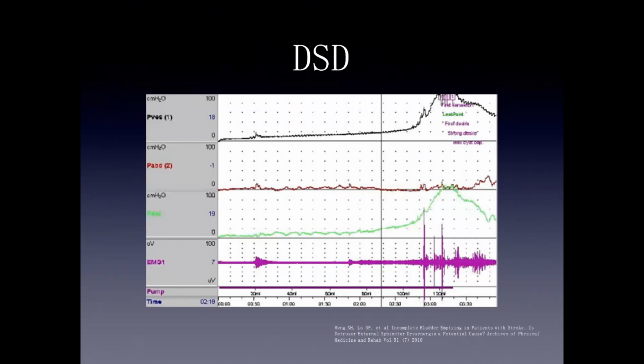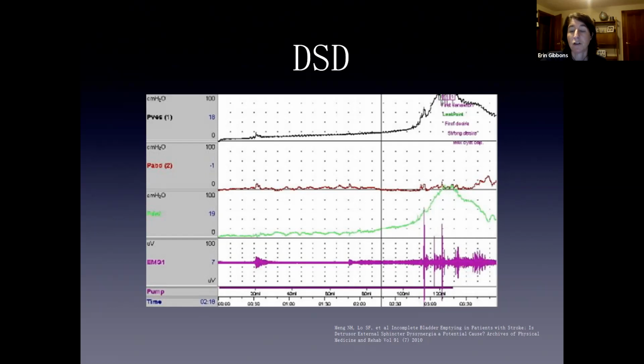You mentioned that it could be DSD or a pelvic floor, like the person is not relaxing his pelvic floor, but how do you make the difference? So yeah, it's really honestly based on if they have a known neurologic condition. So if you have a patient who does not have known multiple sclerosis or doesn't have a spinal cord injury. You'll see this sometimes in young girls, right? They're kind of like a Hinman's bladder. They can't relax their sphincter. So sometimes you'll see that.